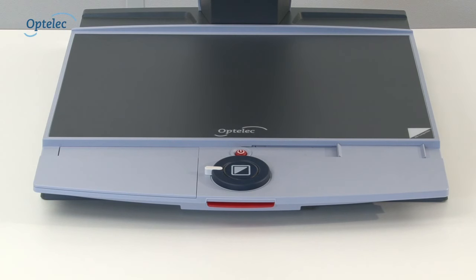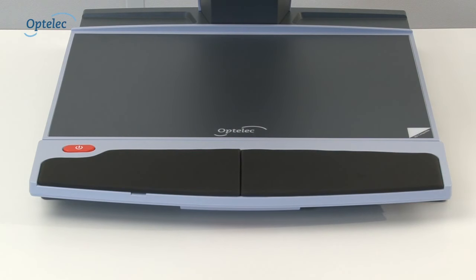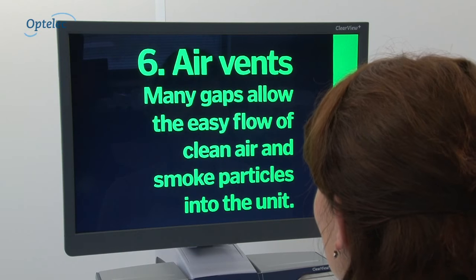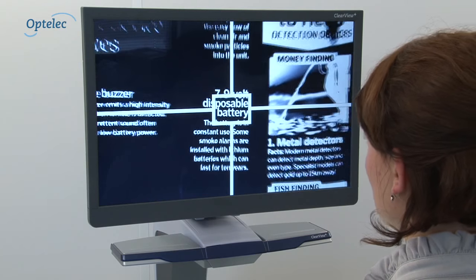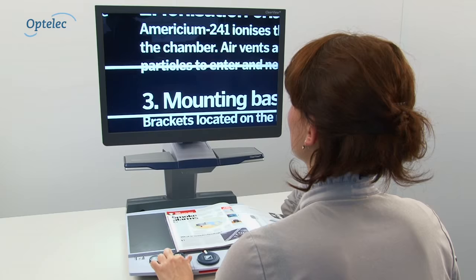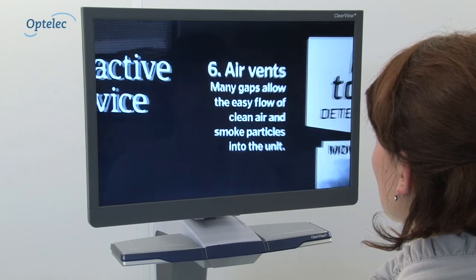Besides selecting the camera and screen, you have the option to add additional functionality to your Optelec Clearview Plus by choosing a feature pack. Imagine being able to change the foreground and background colours for easier reading. Other options include the Find function, Pointer, Reading Lines, Windows, No Buttons and Automatic Zoom.